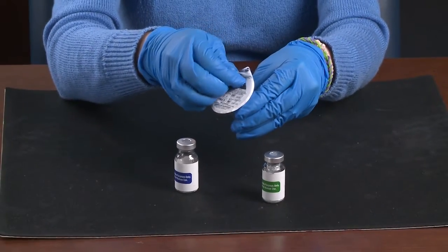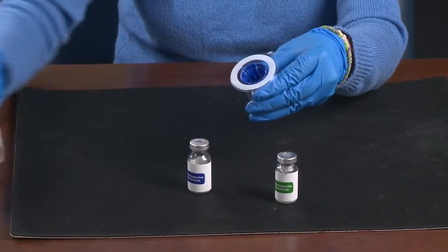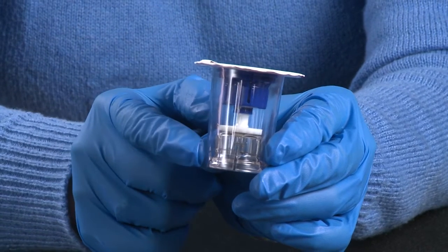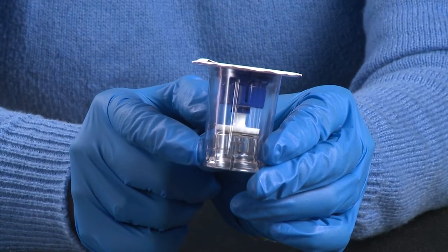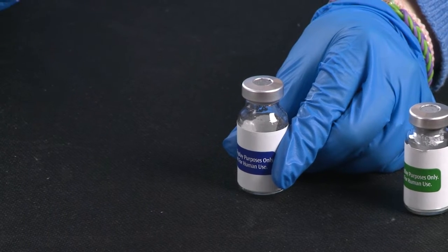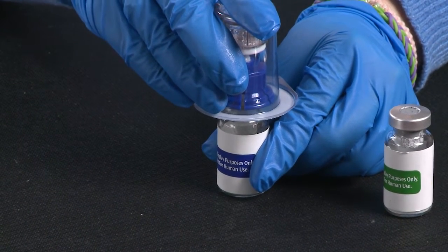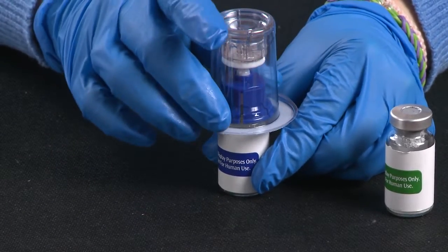Peel off the top of the Mix 2 vial, but don't take the transfer device out of the package. The blue end is for the sterile water. The clear end is for the factor. Hold the sterile water vial steady and use your other hand to turn the Mix 2 vial and push the blue end into the sterile water vial. Make sure it goes in all the way.